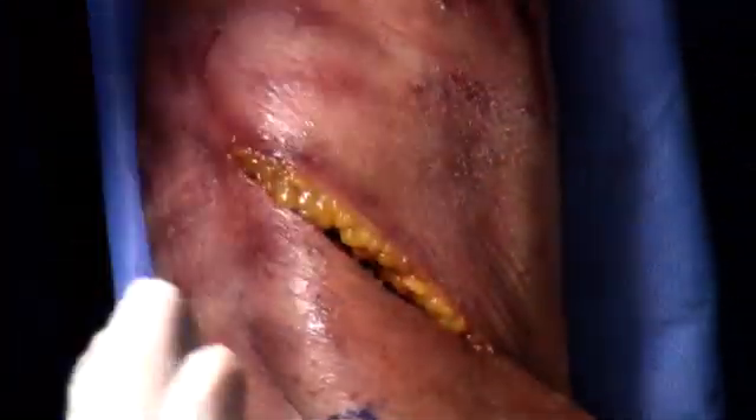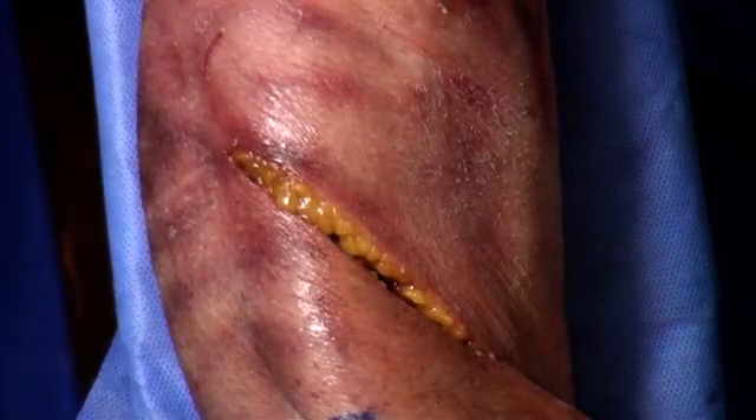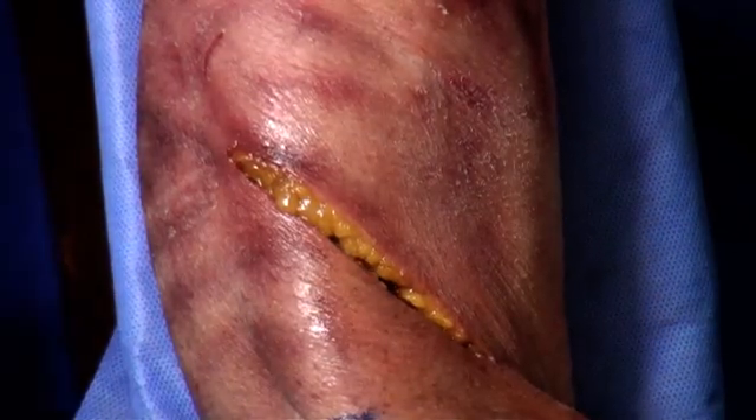We're not putting screws in this demonstration — we don't have any screws. It's just placing the implant here. Please proceed with inserting the implant.